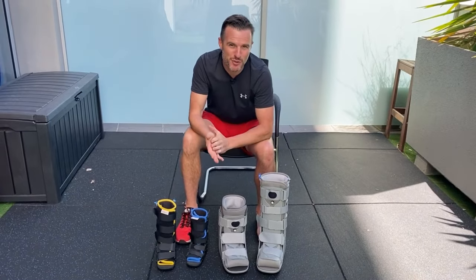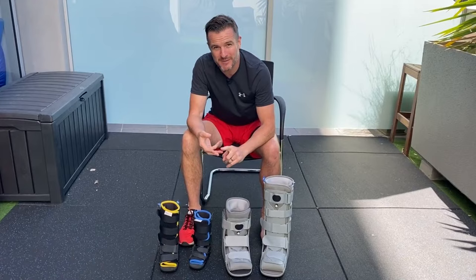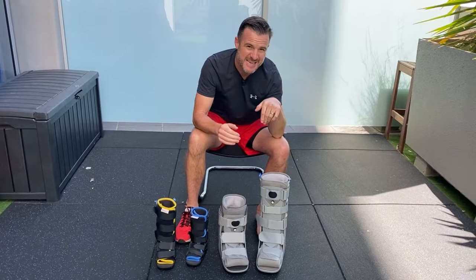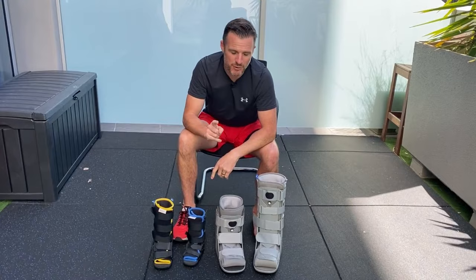For those of you who are about to go in a walker boot, or you're already in a walker boot — maybe you've had a fracture, surgery, an achilles rupture or repair — this video is for you. We're going to go through the range of boots, how to put one on, how to get it tight and snug, what's inside the boot, and how to walk properly with it.